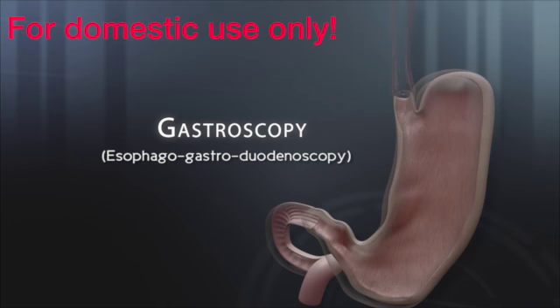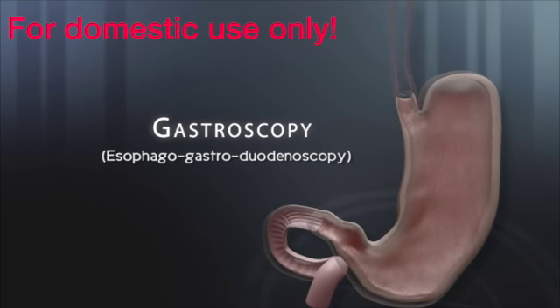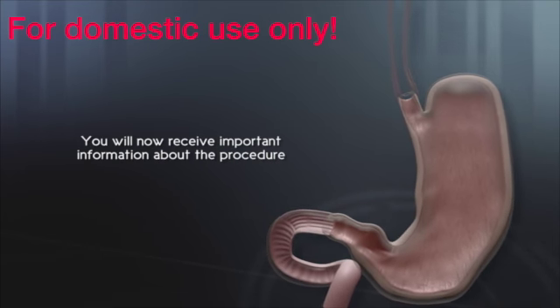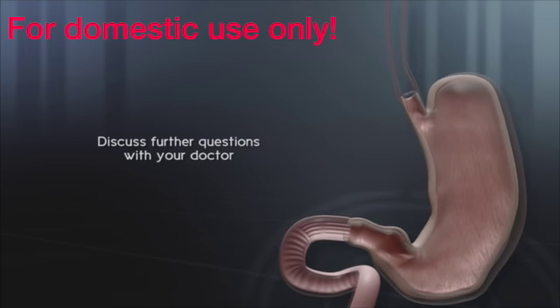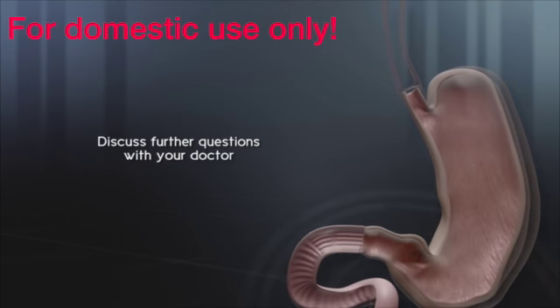Dear patient, within the following minutes we will inform you about all important aspects of a gastroscopy, for example, the procedure and possible clinical pictures. Your attending physician will discuss all your questions and possible risks of the examination.